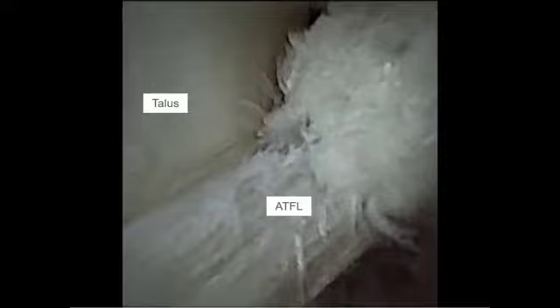The remnant ATFL ligament is debrided, and the anatomic footprint of the talus is prepared. We then see the ATFL and its insertion onto the talus. For the sake of the demonstration, the native ATFL is transected with an arthroscopic scissor and the area further debrided with a shaver. The talus is then denuded of cartilage at the anatomic insertion site until subchondral bone is reached, which helps improve healing.